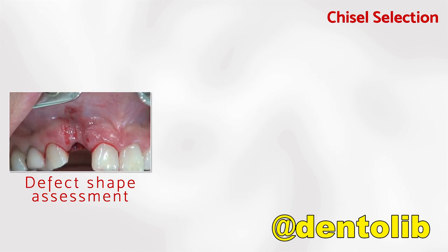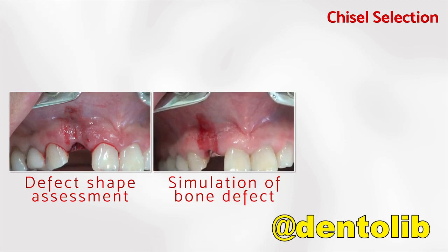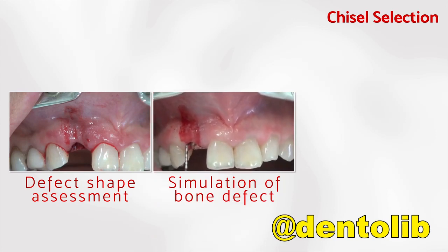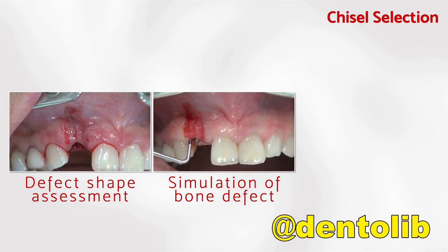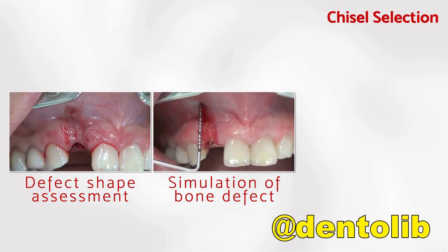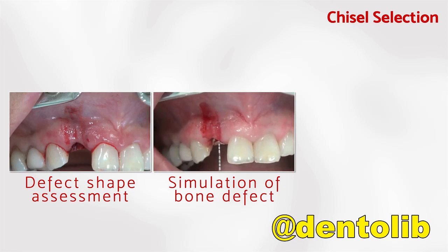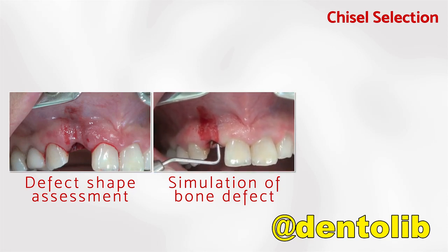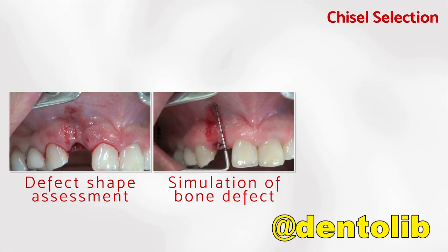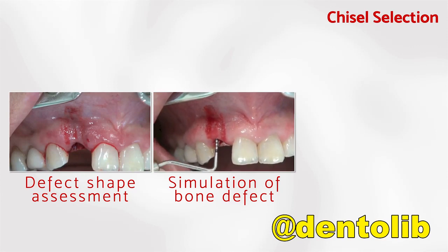In this right lateral incisor, the patient lost completely the buccal wall. And we did here the simulation of the bone defect using blood clot from the socket. And we check, after we did this drawing in the outer portion of the soft tissue, we are going to do here a double check, just to realize if we did right in the first exercise.